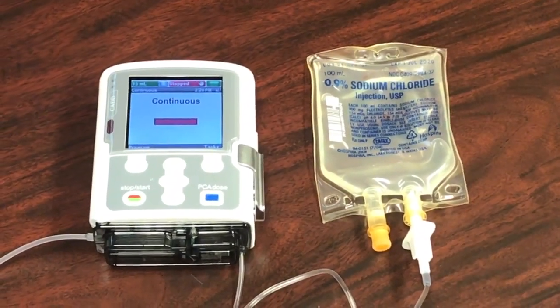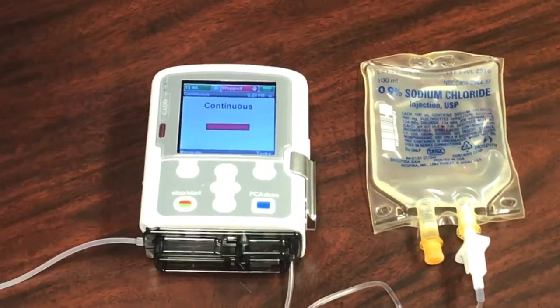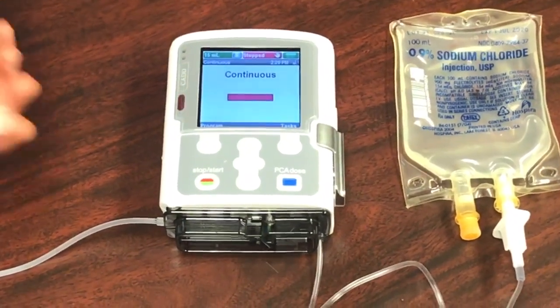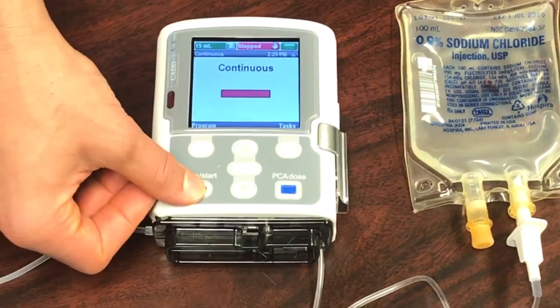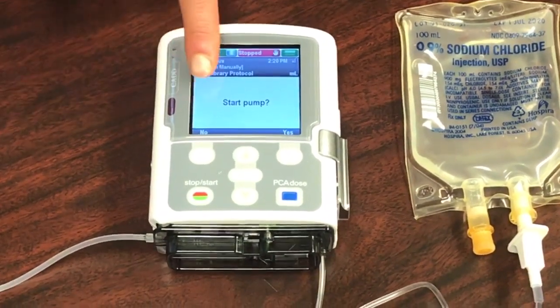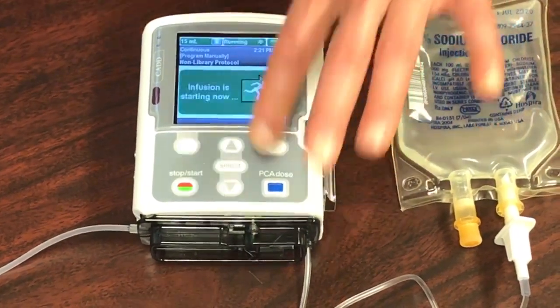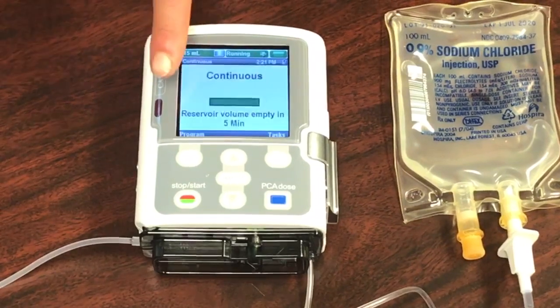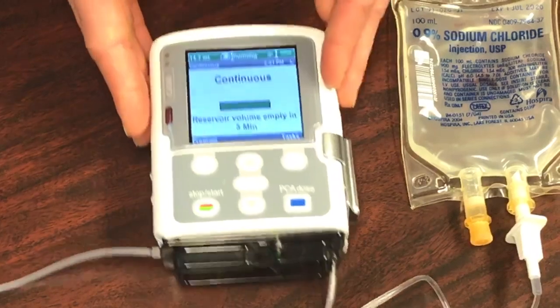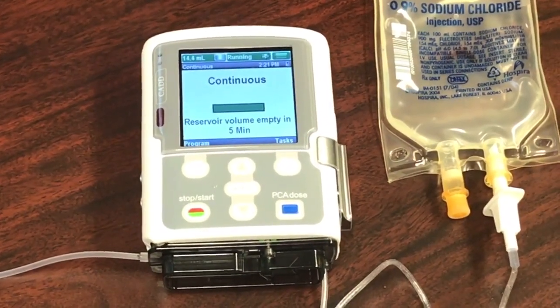The last step to setting up your CADD-Solis pump is simply starting the infusion. Once you've hooked your medication up to your patient, press the Stop and Start button found on your pump. It will give you a message asking 'Start Pump?' — go ahead and press Yes. You'll find that the bar that was once red is now green. When you see that the bar is green, it means that you're getting the infusion. And that is how you set up the CADD-Solis pump.